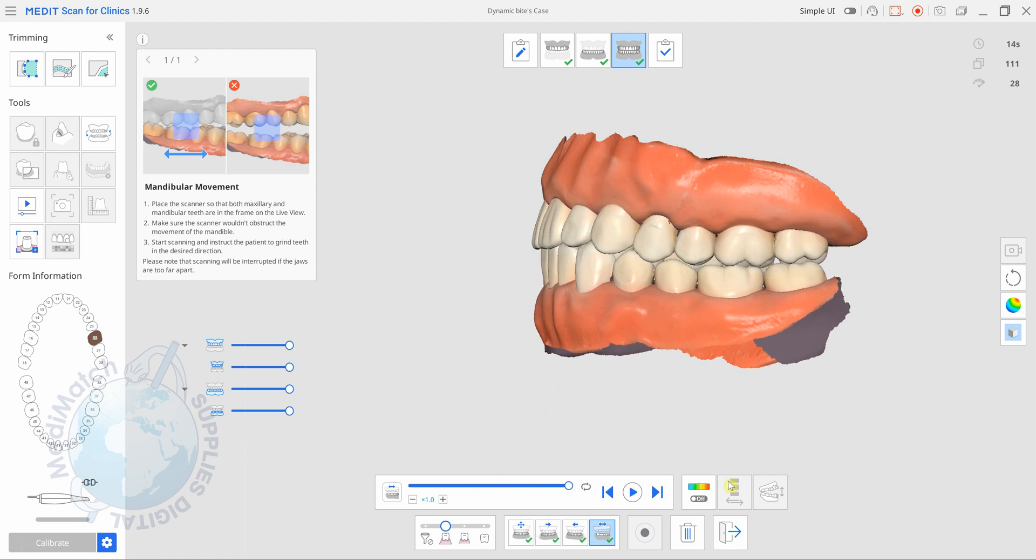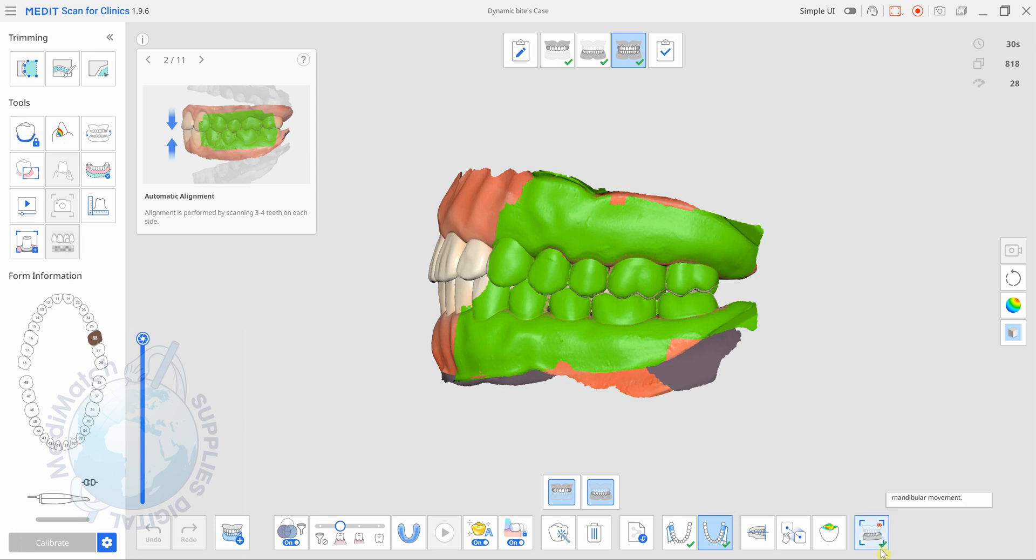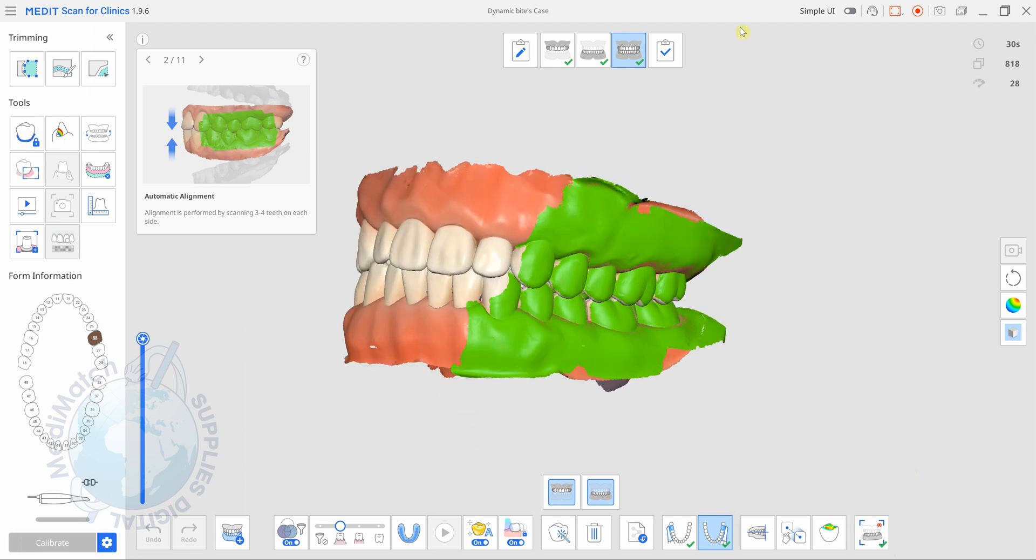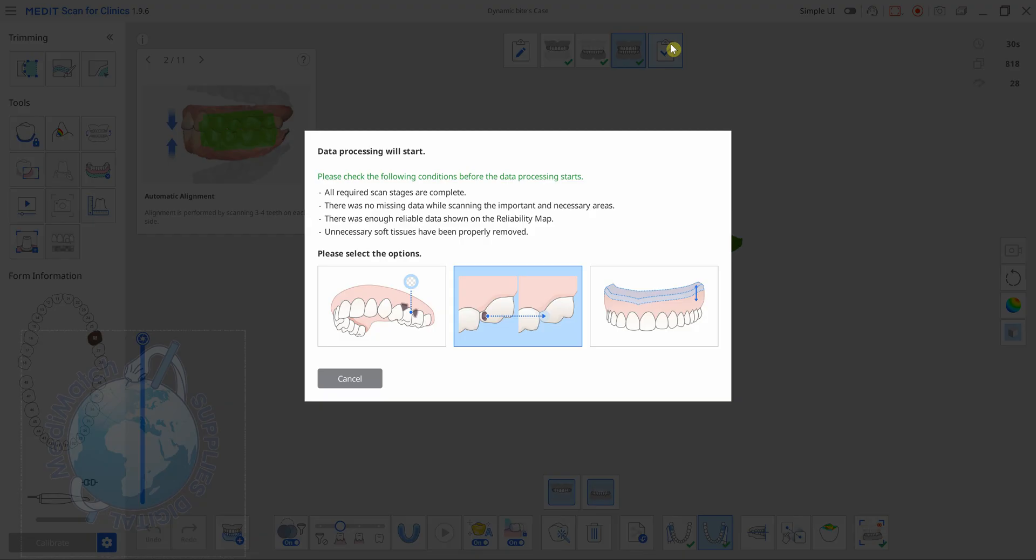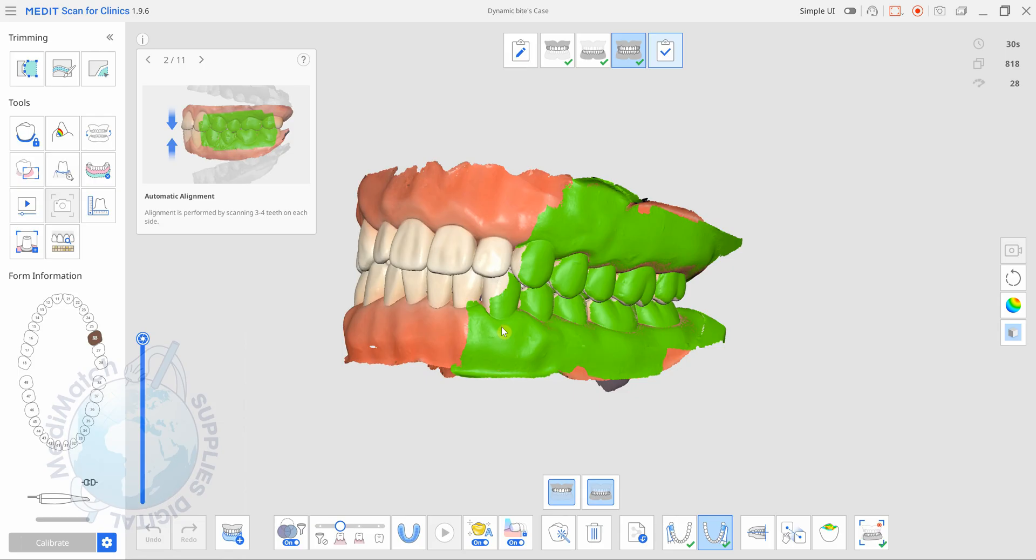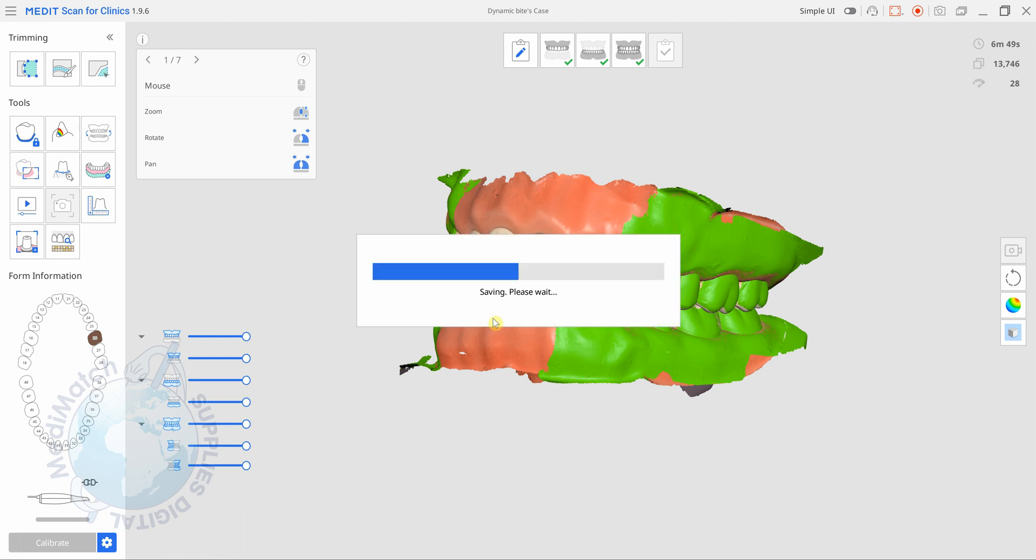Okay so once we're happy we can click the exit button down here and you can see we've now got a little tick next to the mandibular movement icon in the bottom. So we can press save, save the case and then each of those mandibular movements will be saved in our file viewer in MeditLink.